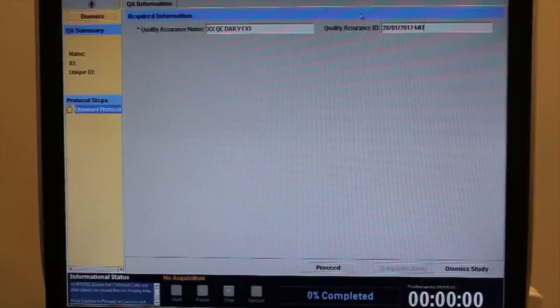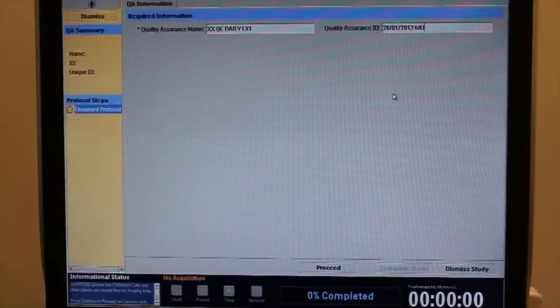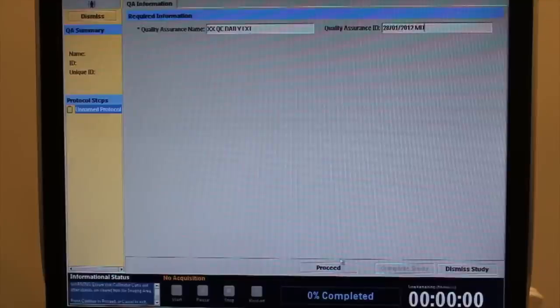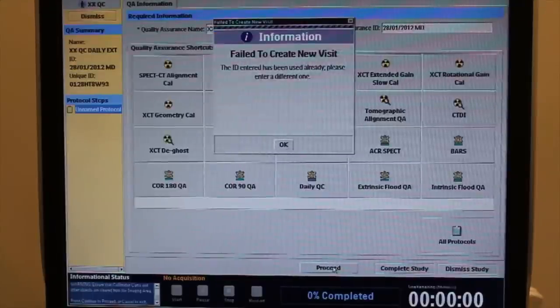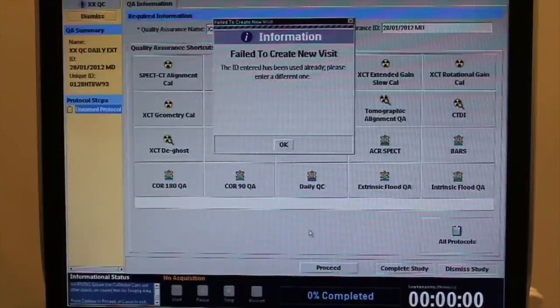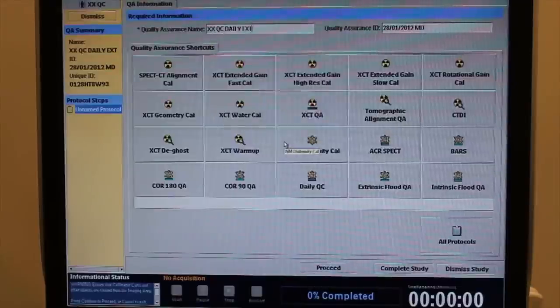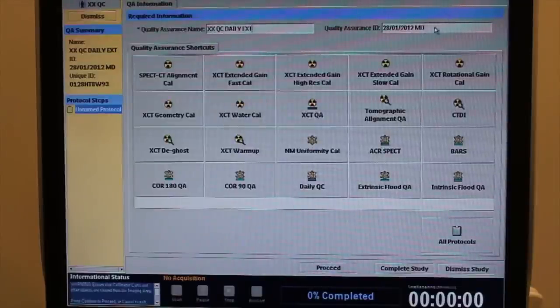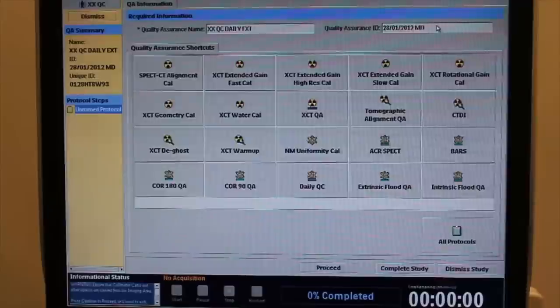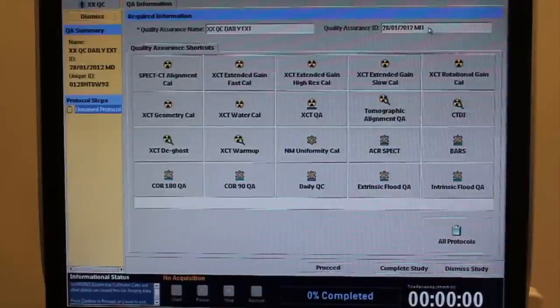For the study ID, enter the date and your initials. If you have used this ID already, add a letter following your initials.